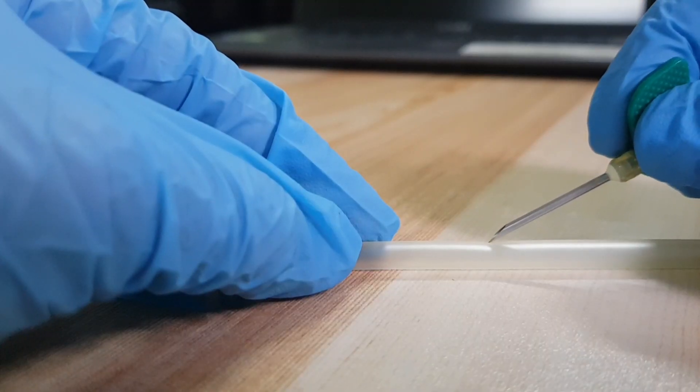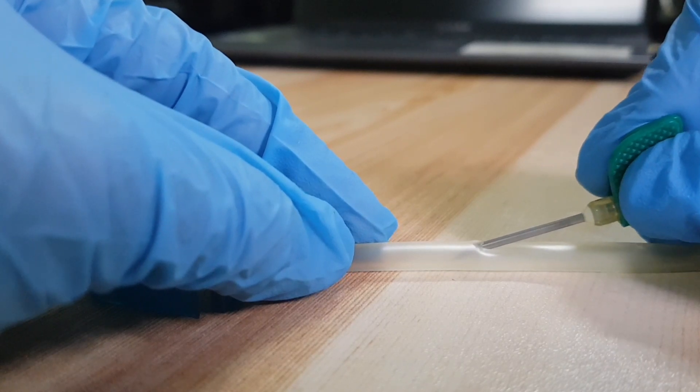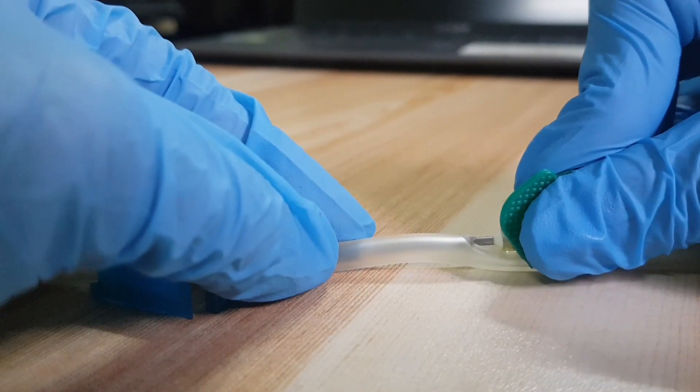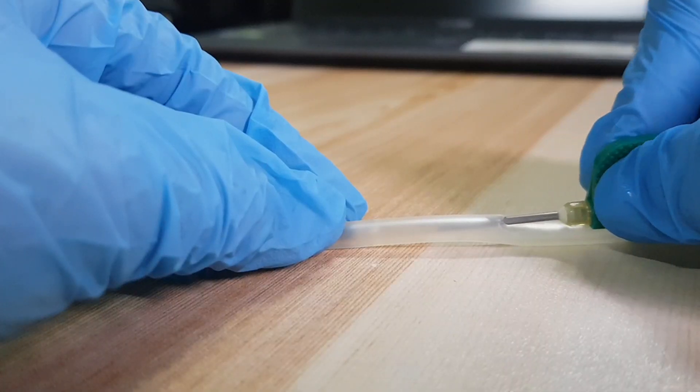I've mentioned following the angle of the bevel. This is to avoid traumatizing the integrity of the vessel inside. This is the same as when cannulating — you insert it at a 25-degree angle, then once blood flashes, you flatten the angle parallel to the skin and advance slowly. De-cannulating on the other end is the entire opposite: you start it flat parallel to the skin and end it at a 25-degree angle.